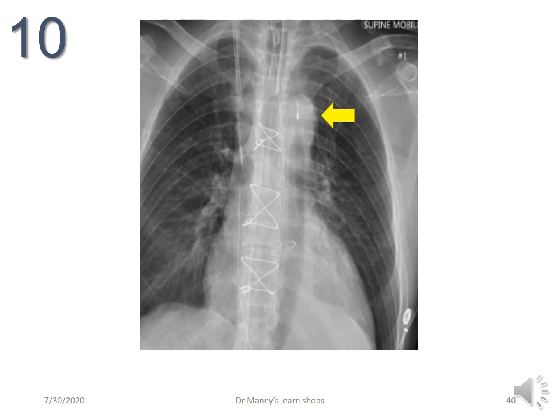The ECG electrodes seem to be off the chest. However, the arrow is pointing to the intra-aortic balloon catheter, and the tip seems to be located in the aortic knob. So therefore, the problem is probably that the IABP catheter is too high.